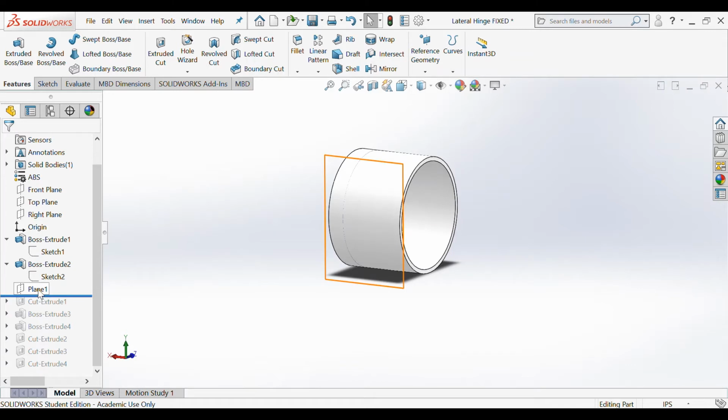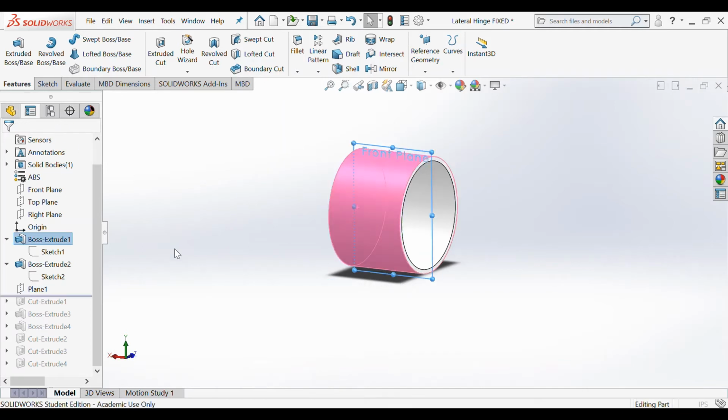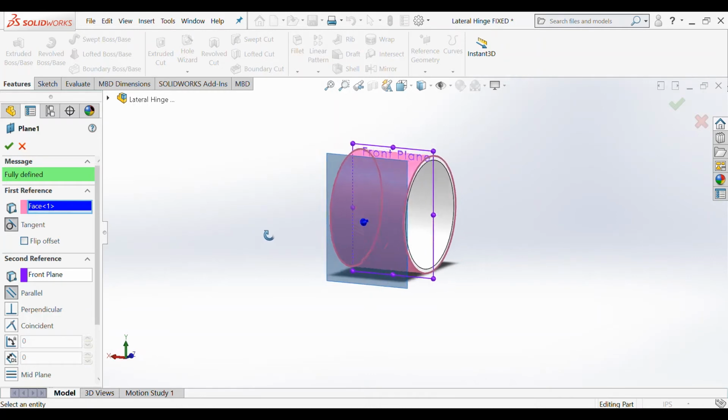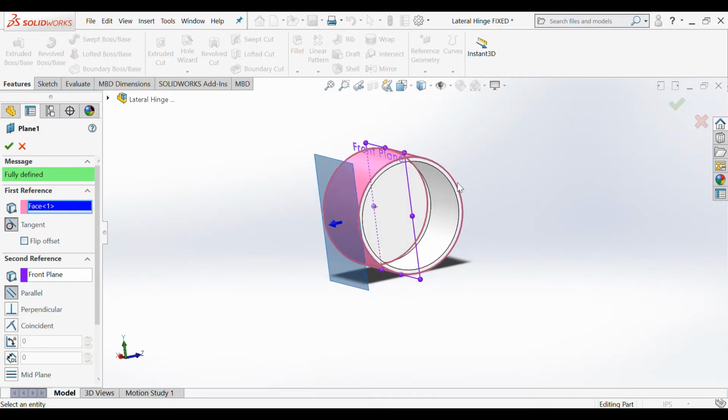Next, we create a reference plane. So you go up to Features, Reference Geometry, and a Plane. And we use the first reference as the face of this outside cylindrical surface, and the second reference is the front plane of our recent extrusion. This creates a plane tangent to the surface, parallel to the front plane of the piece.